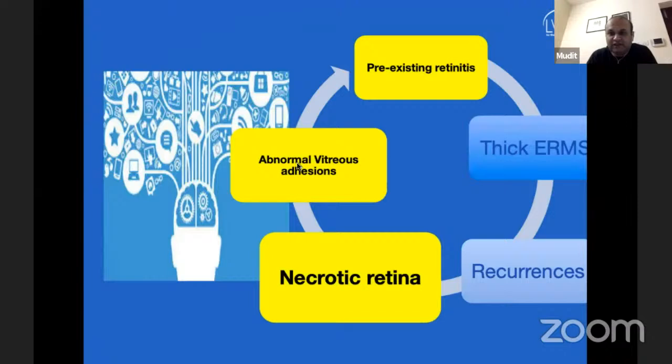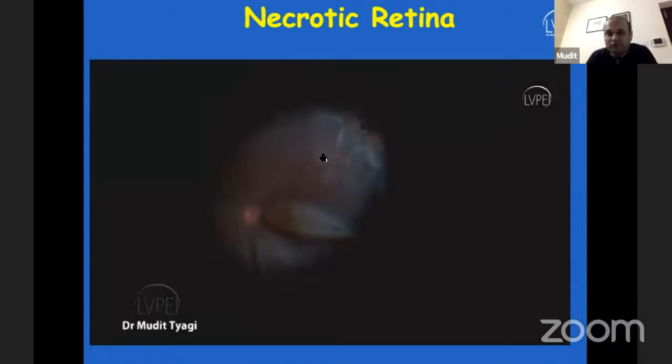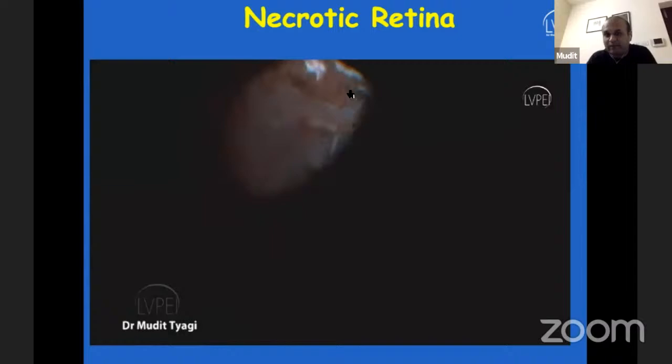The next point is the fact that the peripheral retina is necrotic. So this is how the retina in an ARN RD might be. You see this peripheral sieve-like appearance. You've got this detached retina, and you see this entire peripheral retina. This is all necrotic, with sieve-like multiple breaks, which is what you see in these eyes. So you have to trim and remove the vitreous from it, but you have to be aware of this fact.